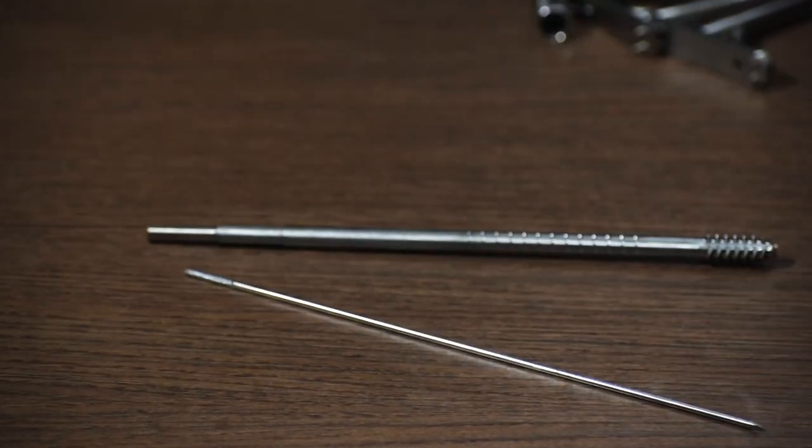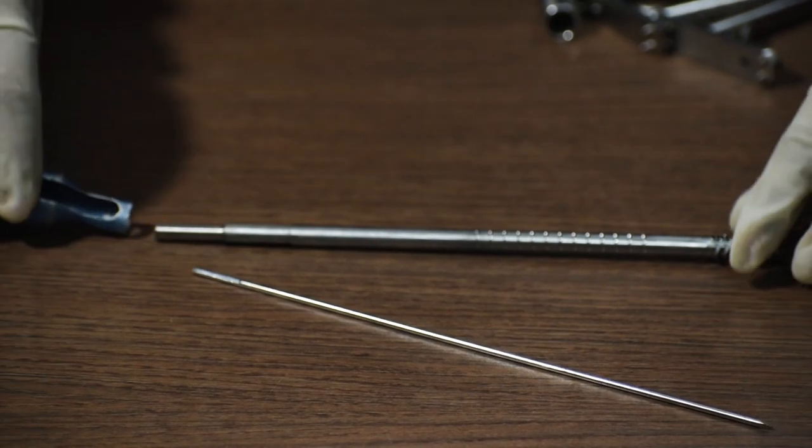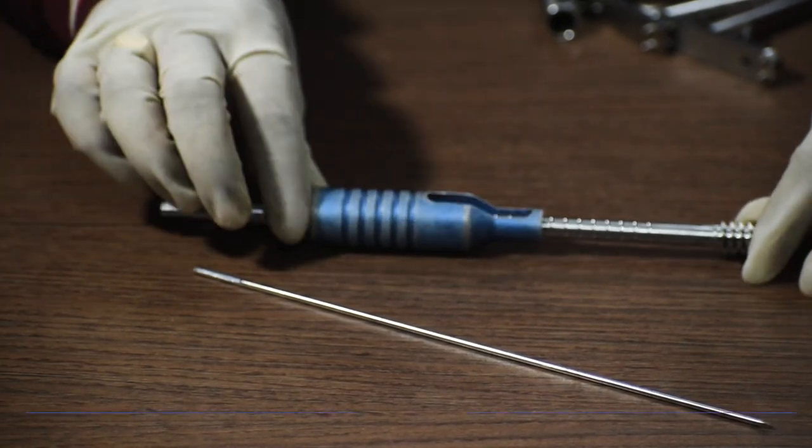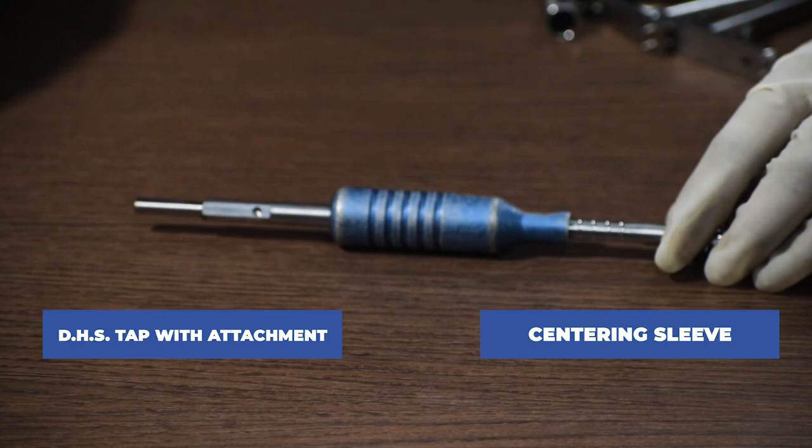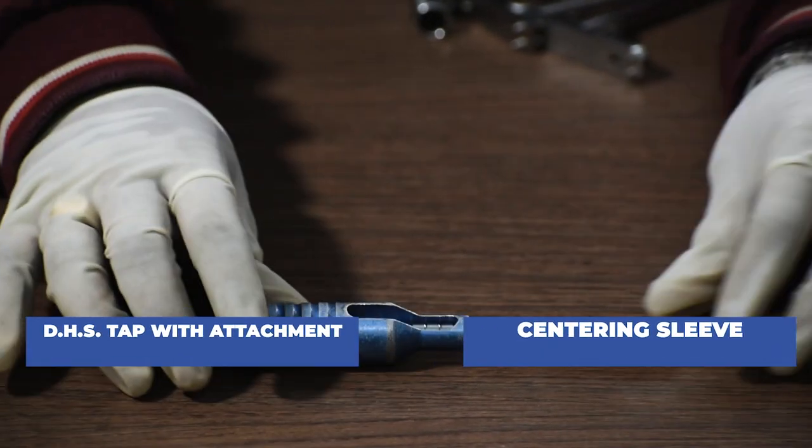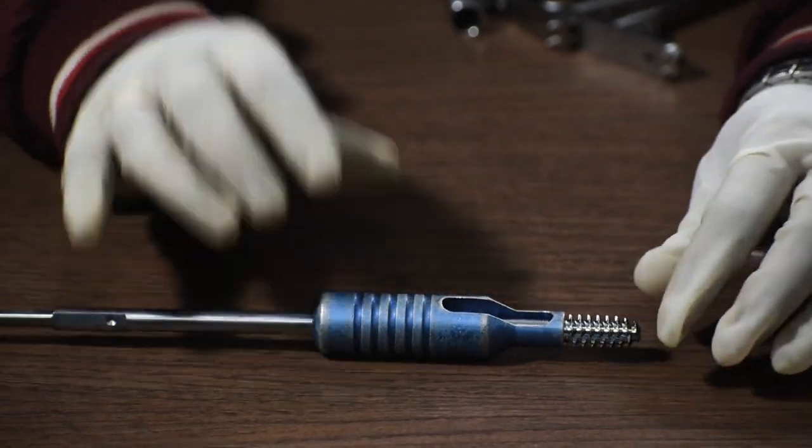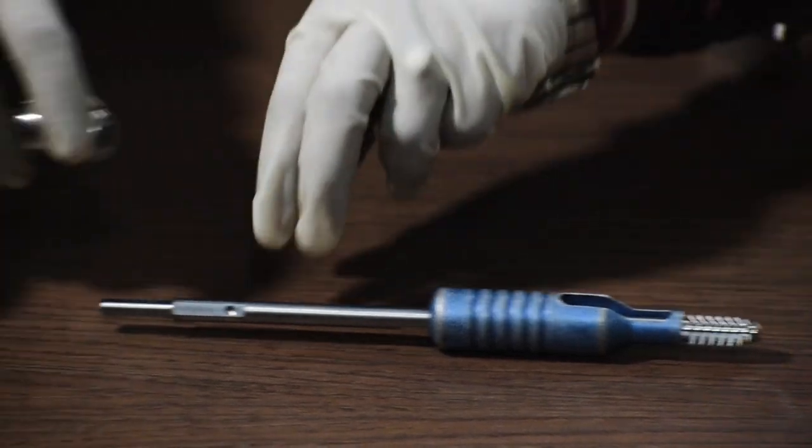After this process, we will use a DHS tap with attachment which is a short centering sleeve. And we attach a QC Handle for better gripping.